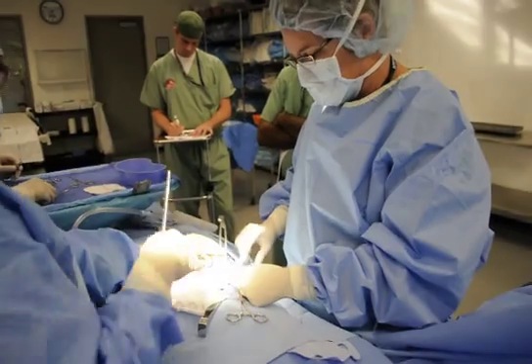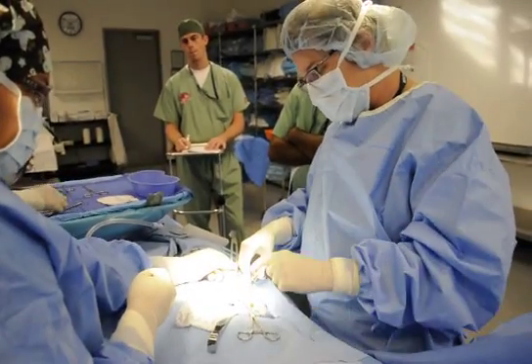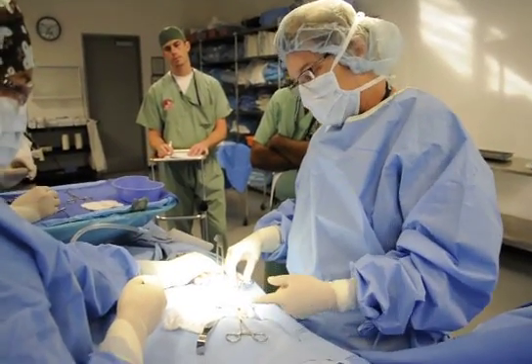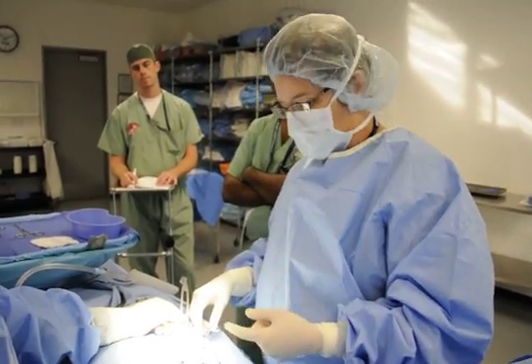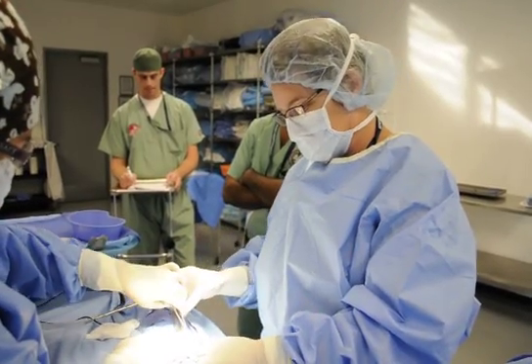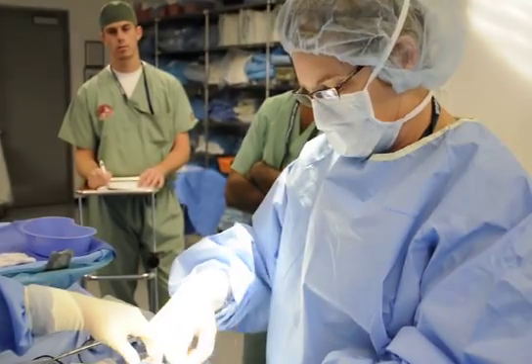Now we're going to do the same thing on the other side. Technically I don't need to tie off this other side because there's no back flow. But pretty soon that's going to be gone, and that clamp is in my way, so I'm going to get rid of it. This is the side that still has the artery — this is the side we want to make sure that we do tie off.